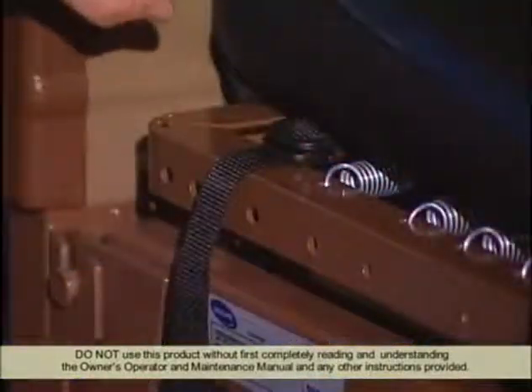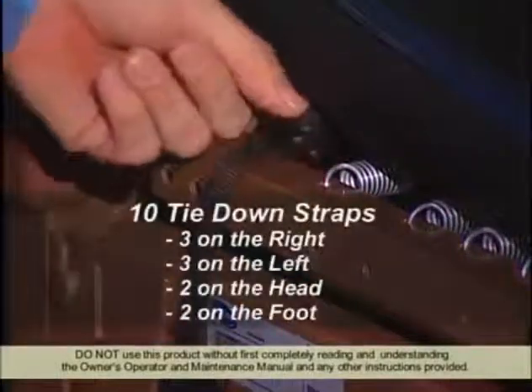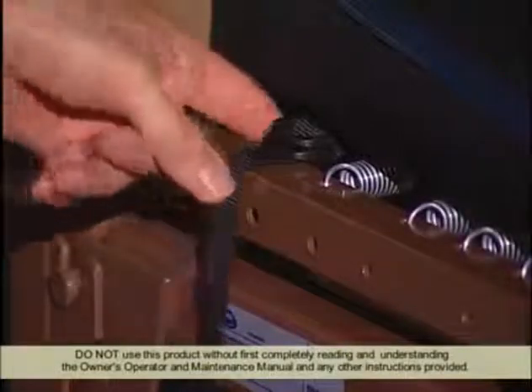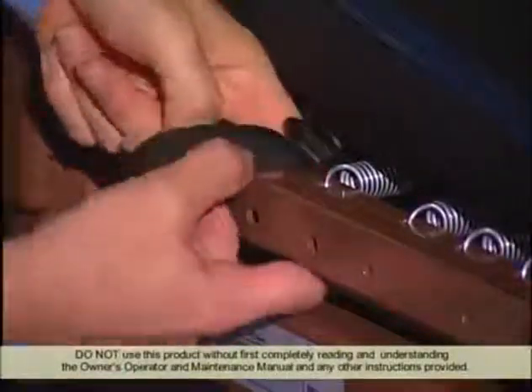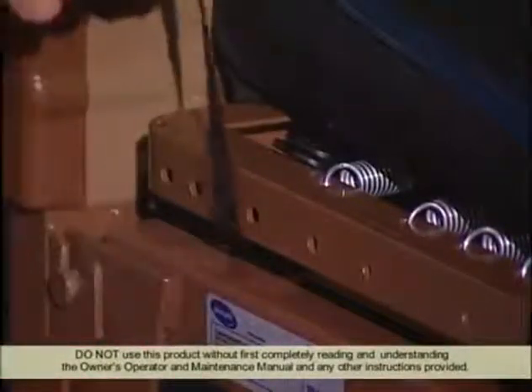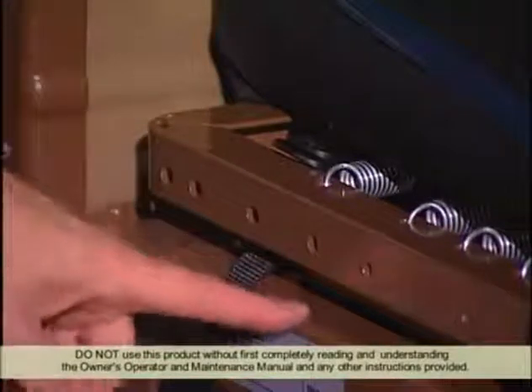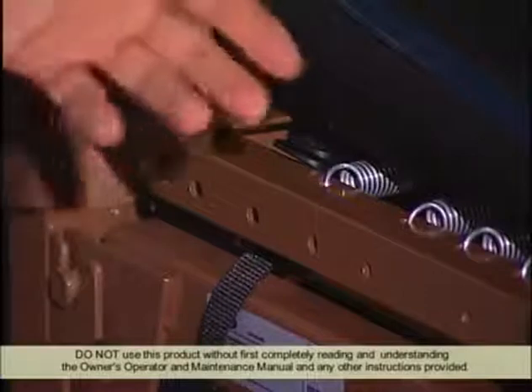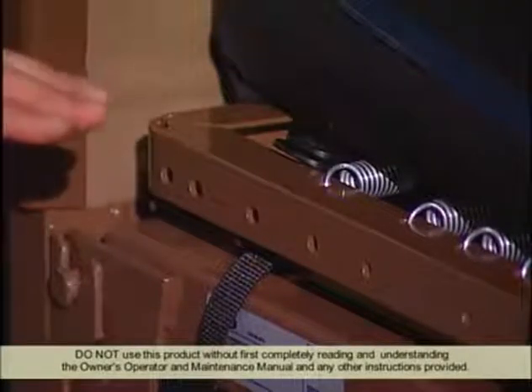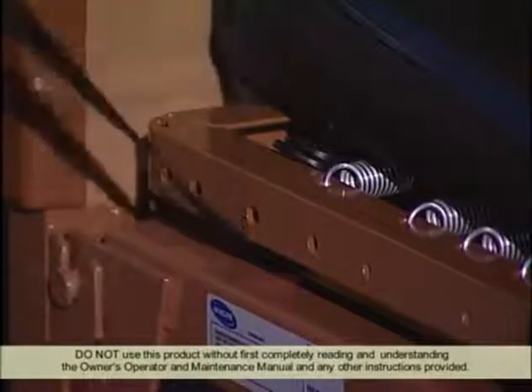As the mattress inflates, use these tie-down straps to attach the unit to the bed frame. There are 10 of them, 3 on each side, 2 on the head and 2 on the foot. Attach them like this. Fasten the strap around the deck section of the bed. Make certain that you go around the deck section of the bed, not the frame of the bed. If you attach the mattress to the frame, you can tear the mattress or damage the bed, or both, when you try to lift the front or back deck section. So make sure you attach the straps to the movable deck sections of the bed.